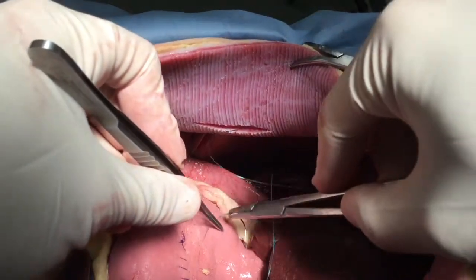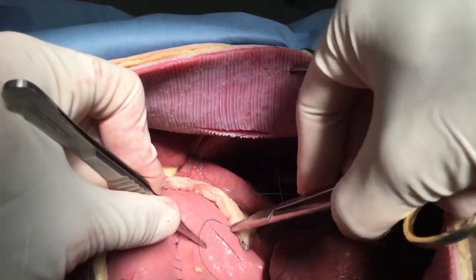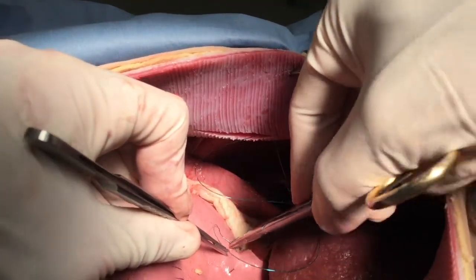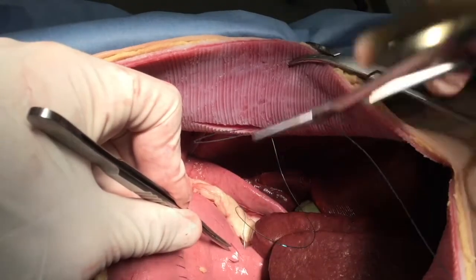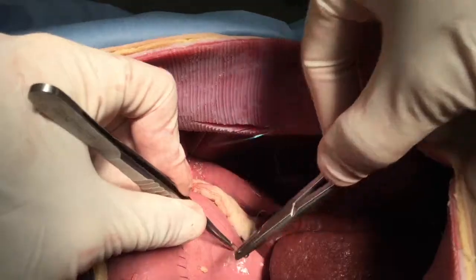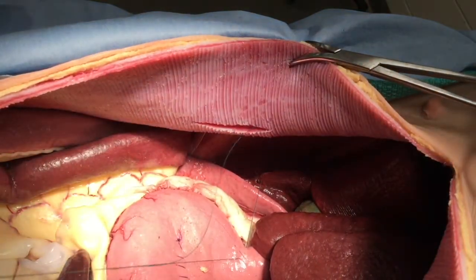Using O or 2-0 monofilament absorbable suture — here we are using Maxon — we are going to oppose the deep, or dorsal, aspects of the incision in the body wall and the stomach, the antrum.